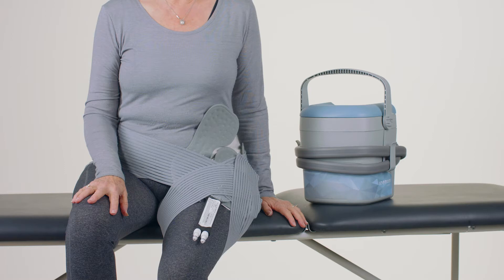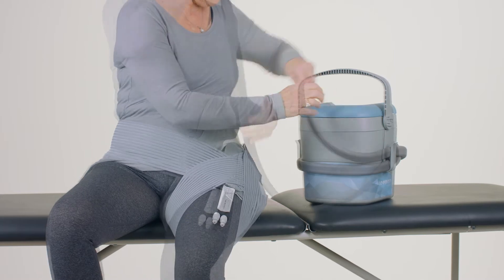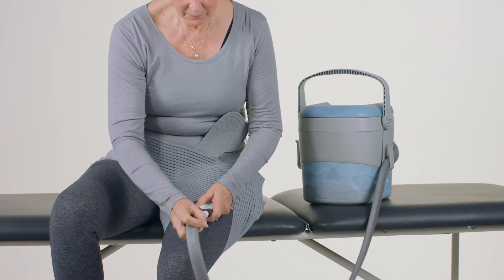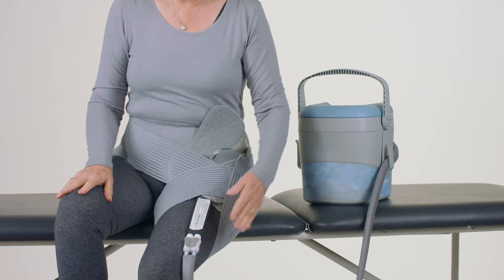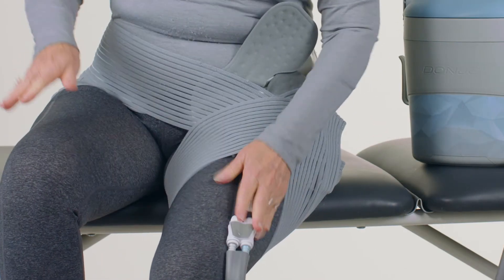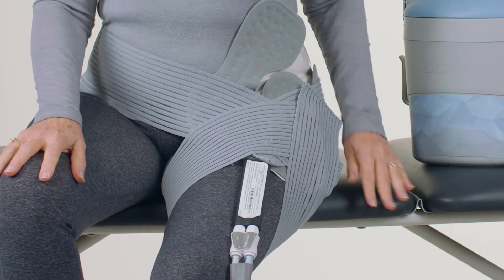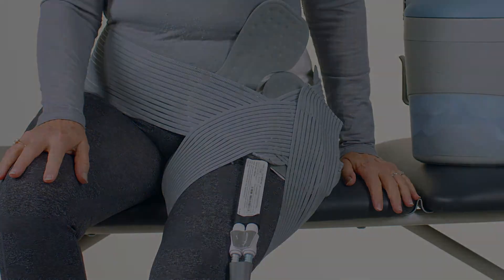Do not wrap the straps so tightly as to restrict blood flow or fluid flow. Connect the couplings on the pad with the couplings on the hose from the unit. Make sure both connections are properly seated — listen for a click on each connector when they are pushed together. Pull on each coupling to see if they are secure. Unless both couplings are properly joined, water will not flow through the system and no cooling effect will be realized.